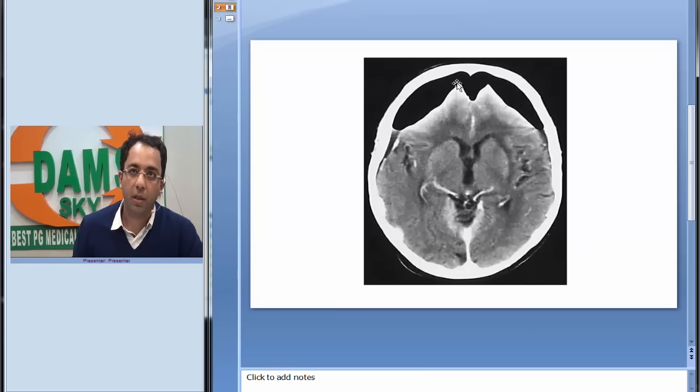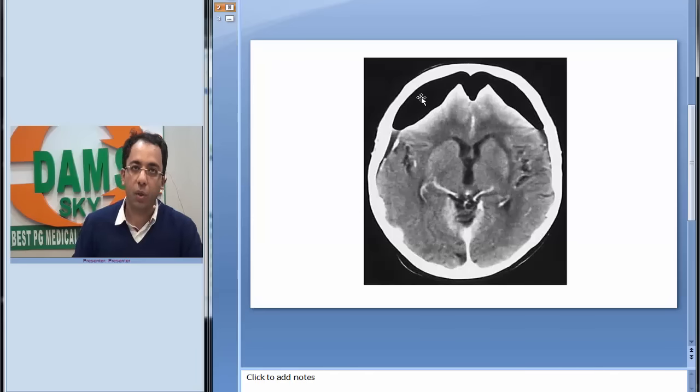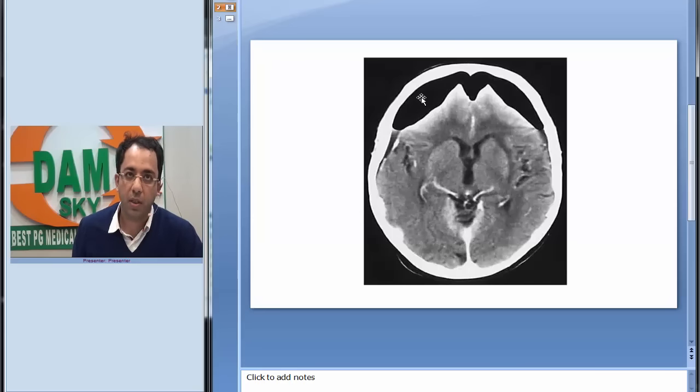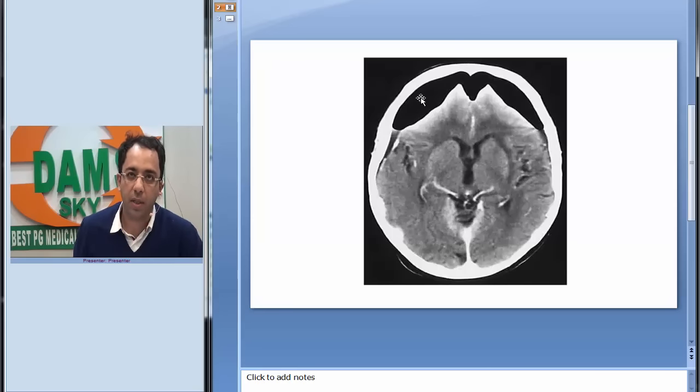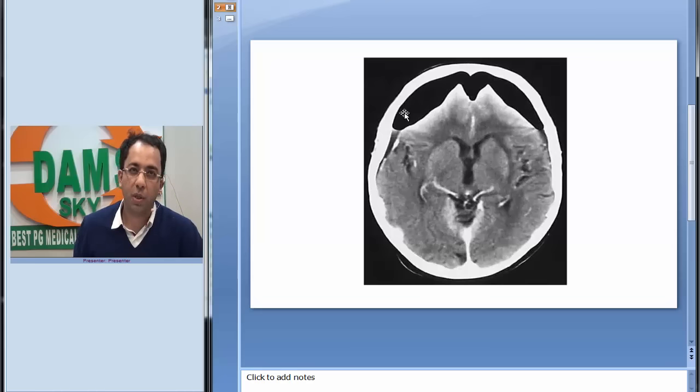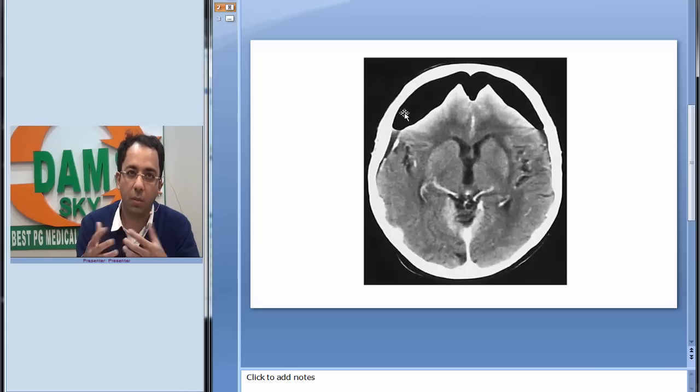You can see some dark area that is totally black. We know from the Hounsfield scale that air on CT scan would look black. This is air. This is a post-operative patient which came to us on a CT operative follow-up scan.